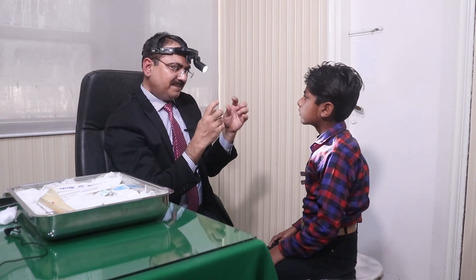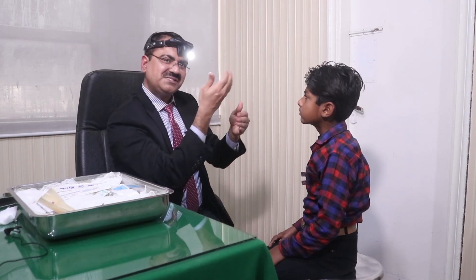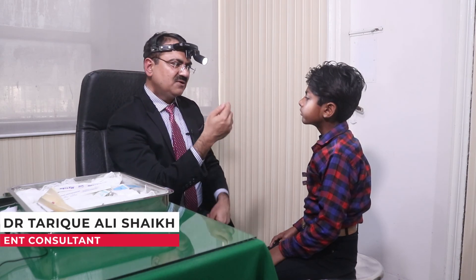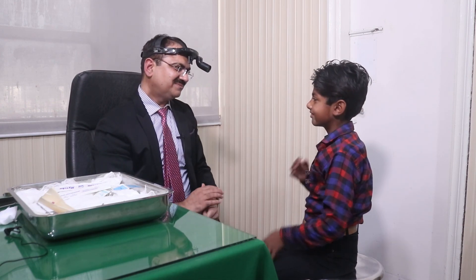If you are given the command of throat examination, you can follow it. But if you are given just the IDL examination, then you see the oral cavity first, then you do the IDL. Thank you very much.